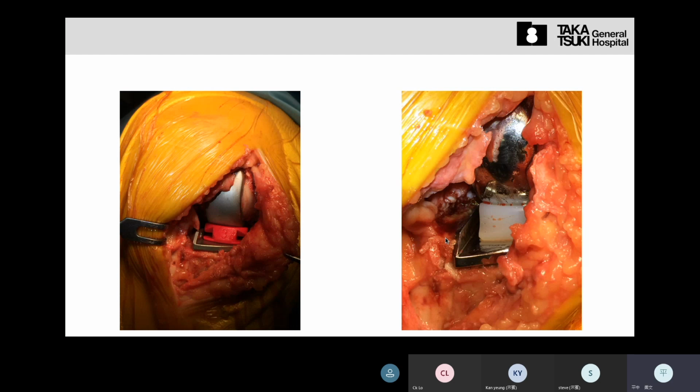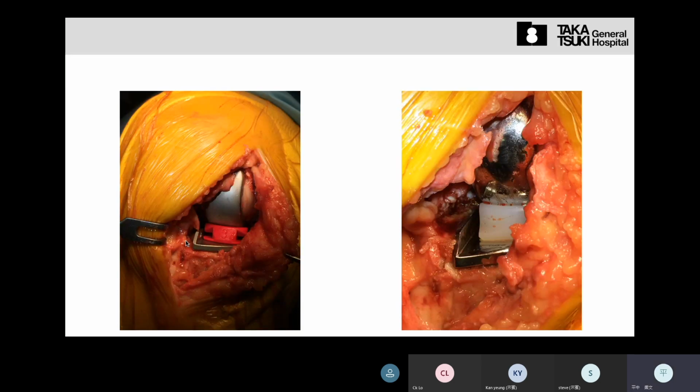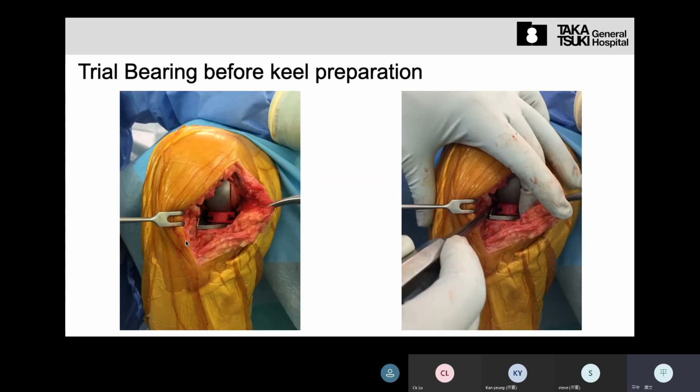So this is ideal, not only 1 millimeter. Then make the keel and fix using cement. The space between the lateral wall and the lateral cutting surface, I filled with cement or bone chips. Okay, this is the tip to prevent the dislocation. By contrast, if at this time you find some poor fitting of the bearing, you should recut the lateral cut before the preparation of the keel.